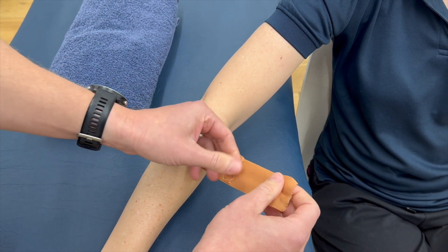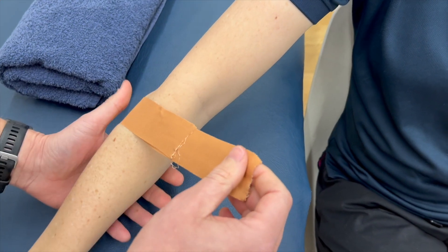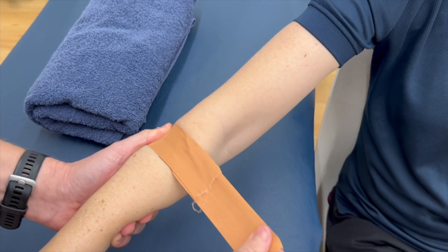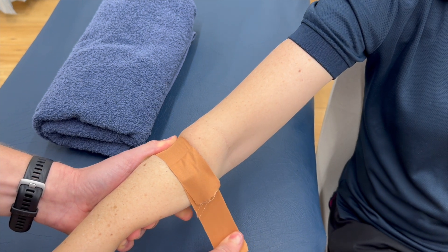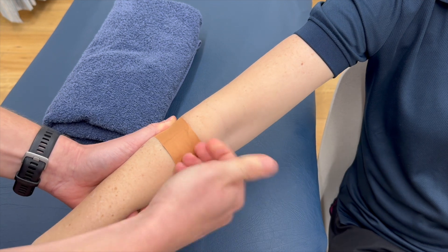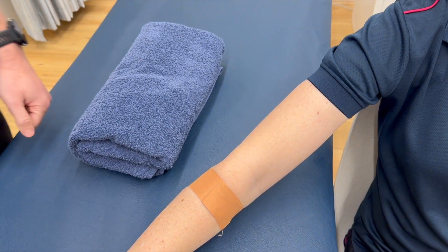We're then going to fold that over, use our thumb to stabilize at the start of the tape, and pull across, down and underneath. Then we'll just tape that down. And that's it.